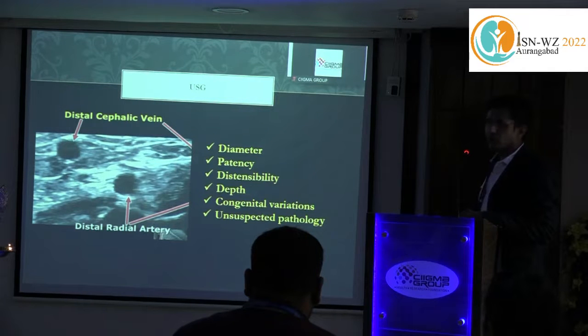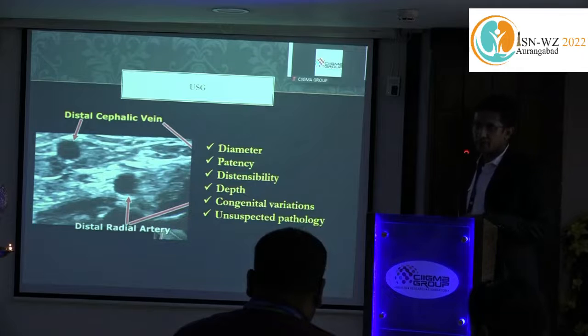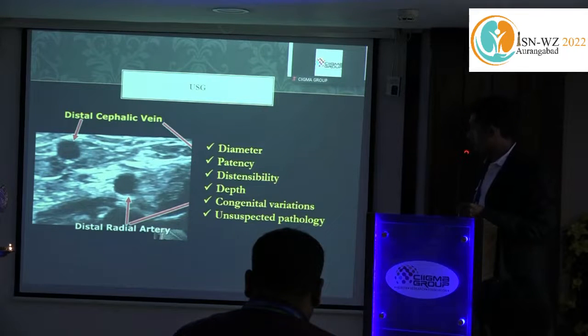Ultrasound also gives you information about vessel diameter, patency, distensibility, depth, anatomical variation and unsuspected pathology. So even if we do a fistula, the ultrasound Doppler becomes mandatory, both pre- and post-op, and that's why it has almost become universal in our practice.